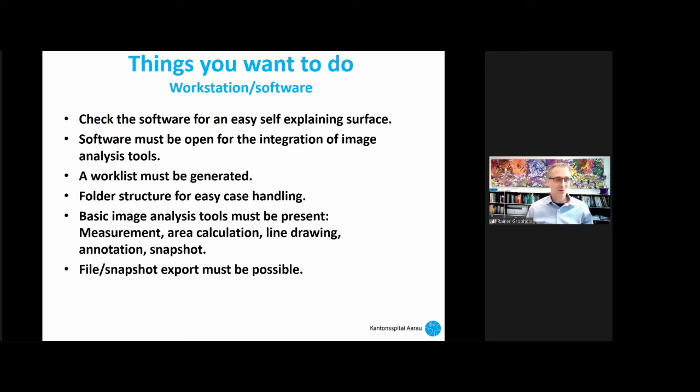So meaning if you go to a certain firm and say, hey, I want this tool now, and they say, okay, we can integrate it for you, but you have to pay for that. So check beforehand how much costs will arise and whether or not these costs are in good shape, or not something the firm uses for advertising their product. A work list, of course, you want to have, with the folder structure for easy case handling, especially for tumor boards and also for resident teaching. Basic image analysis tools we have been talking about, and of course, export must be possible.